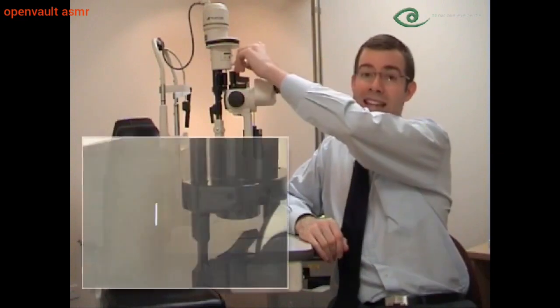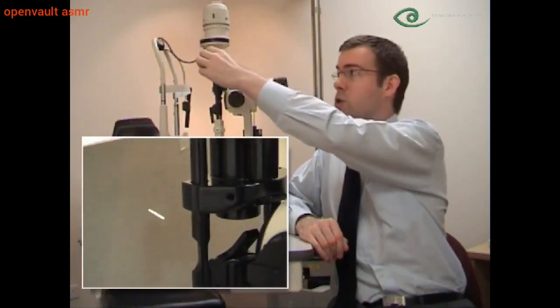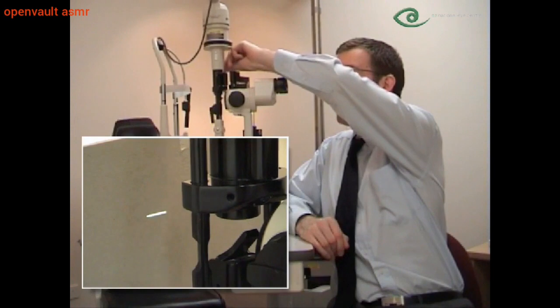Because we want to measure things both vertically and horizontally, we need to be able to rotate the beam of light, and we can do that by pushing this all the way to the left or all the way to the right.